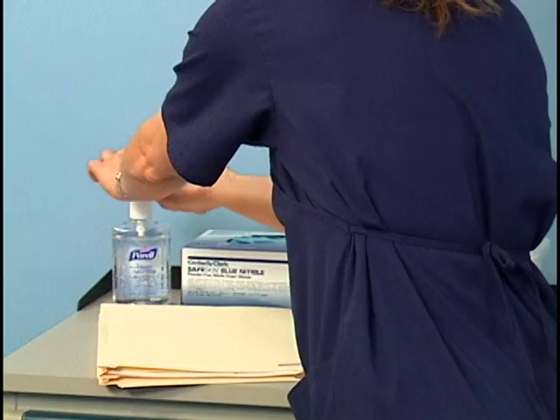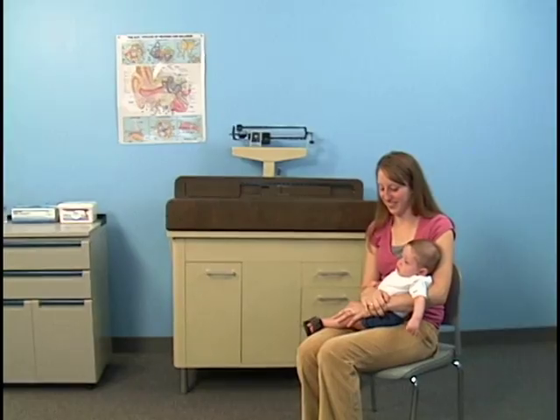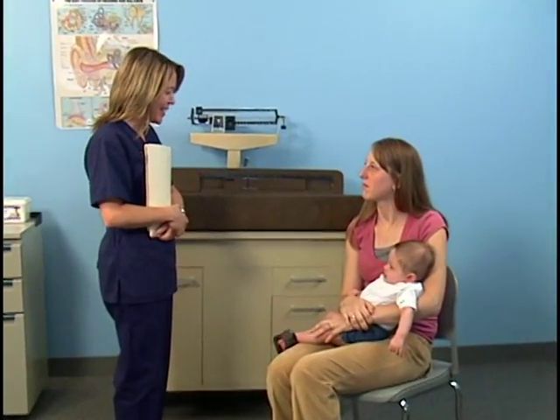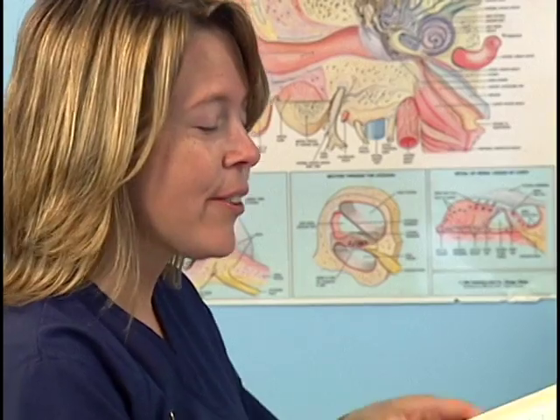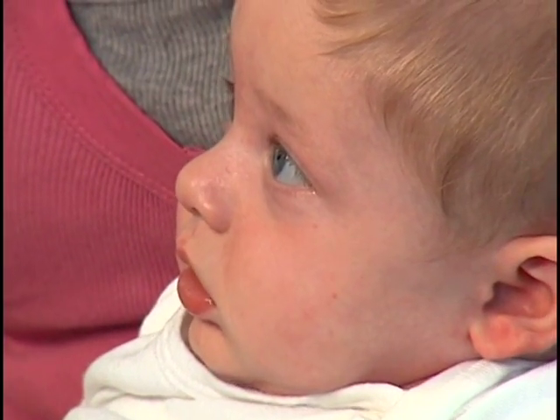Before proceeding, sanitize your hands. Greet the infant's parent and introduce yourself. Hi, Mrs. Jackson. My name is Kim. I'm going to be your medical assistant today. Identify the infant and explain the procedure to the parent. Depending on the medical office policy, ask the parent to remove the infant's clothing and put on a dry diaper, or remove the infant's clothing, including the diaper.